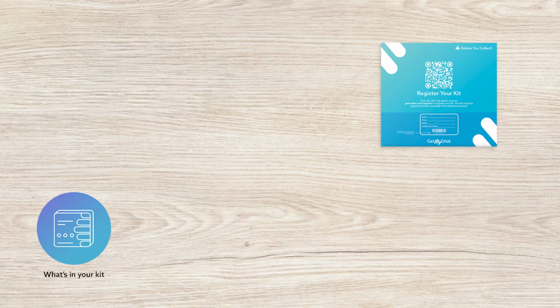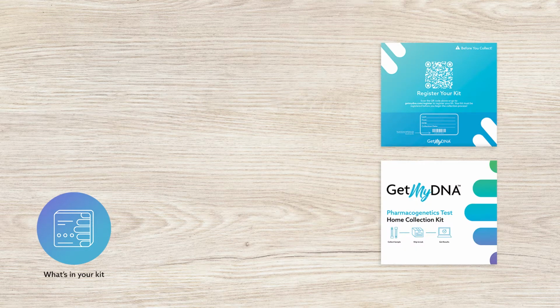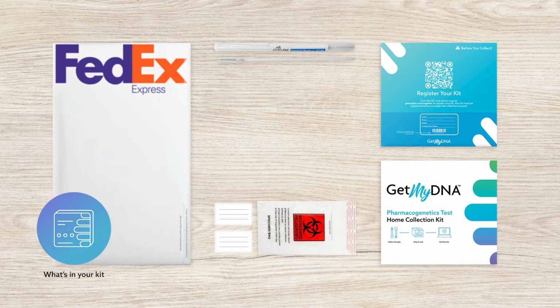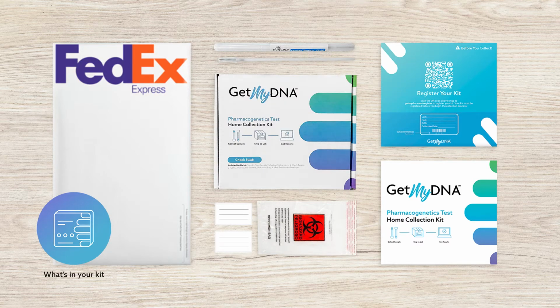In your kit, you will find a Before You Collect Kit registration card, an instructional trifold, 2 cheek swabs in tubes, 2 tube identification sticker labels, 1 biohazard bag, a pre-addressed and prepaid return envelope, and the box your kit came in, which will be the box you will return your sample in, so don't throw your box away.